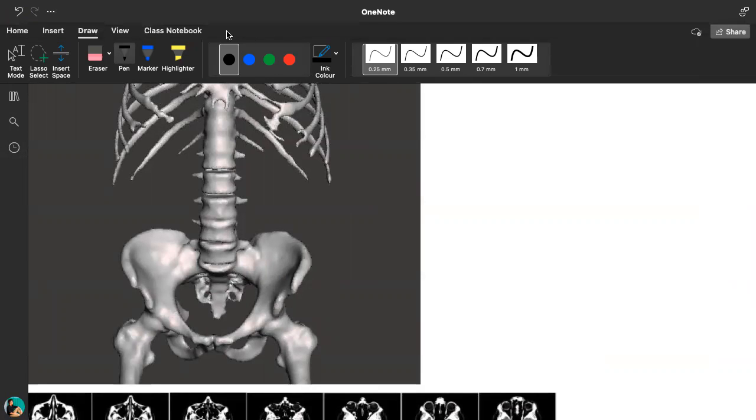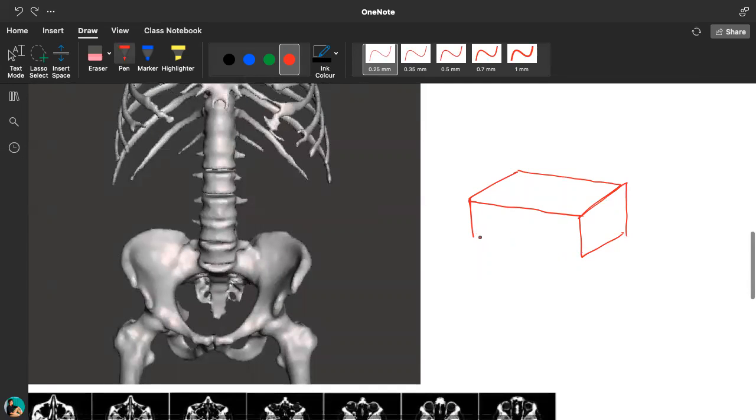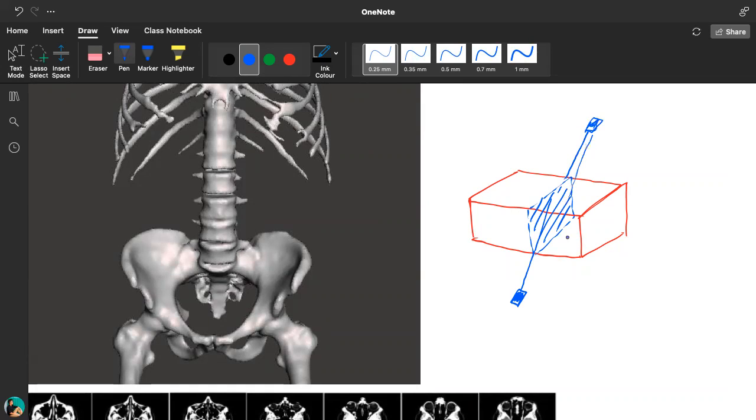If I draw here, let's say you're scanning this one. Here you're just scanning one slice. So if I draw here, only this slice is what you're scanning from different angles. You have the X-ray tube over here. You scan only this slice, and once it rotates over here, again, it only scans this slice.